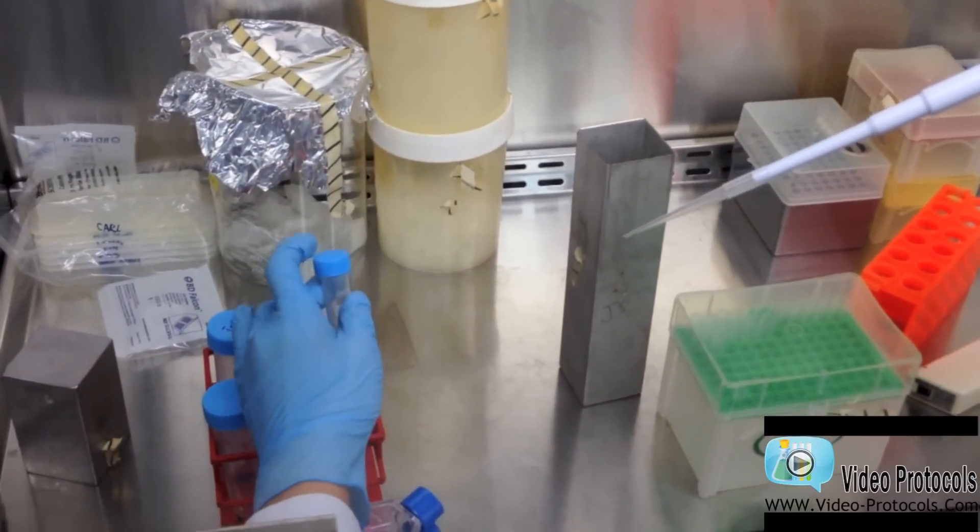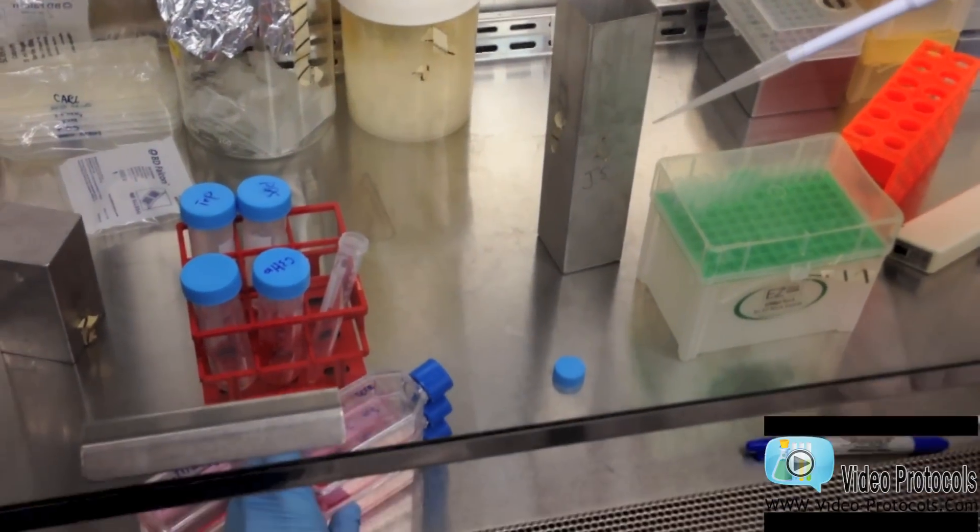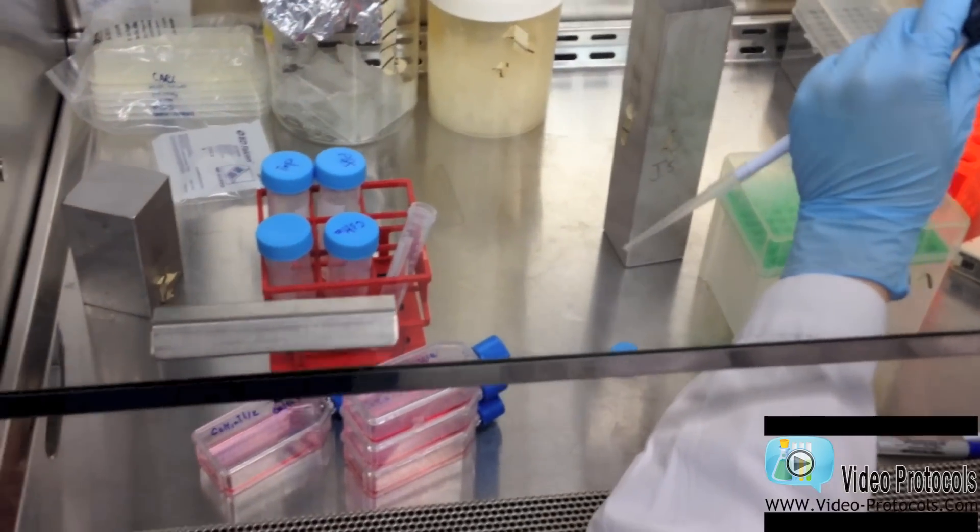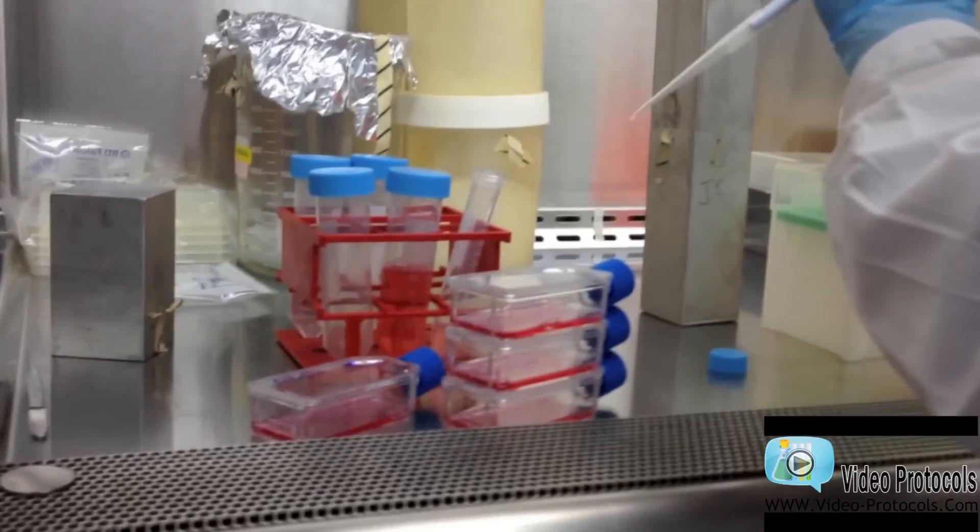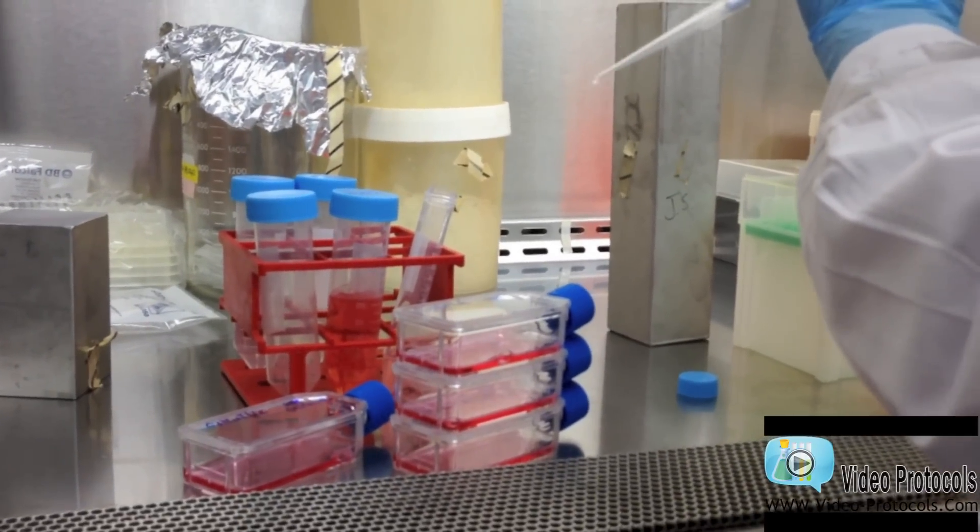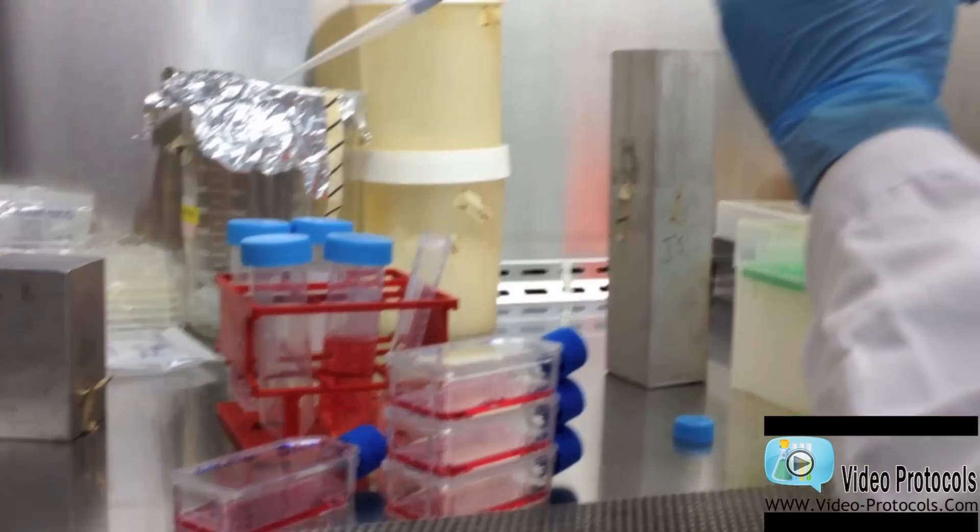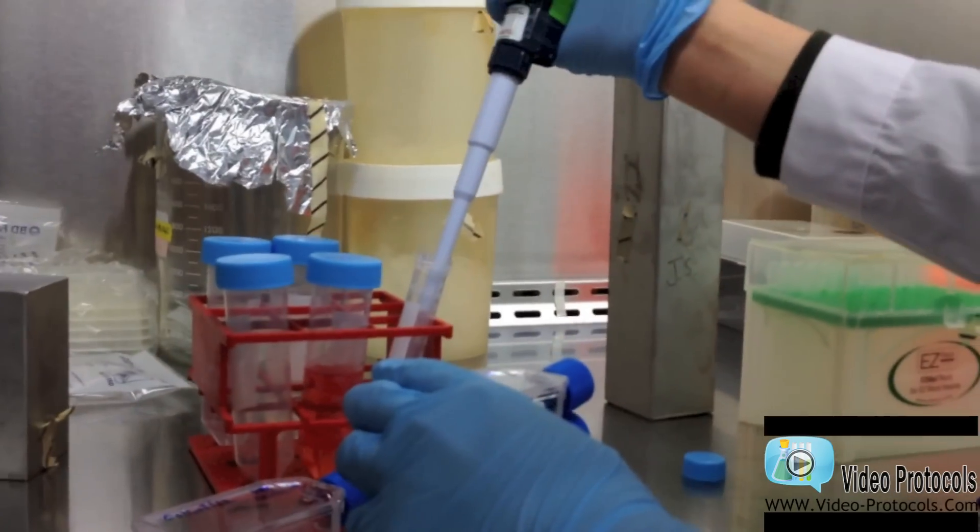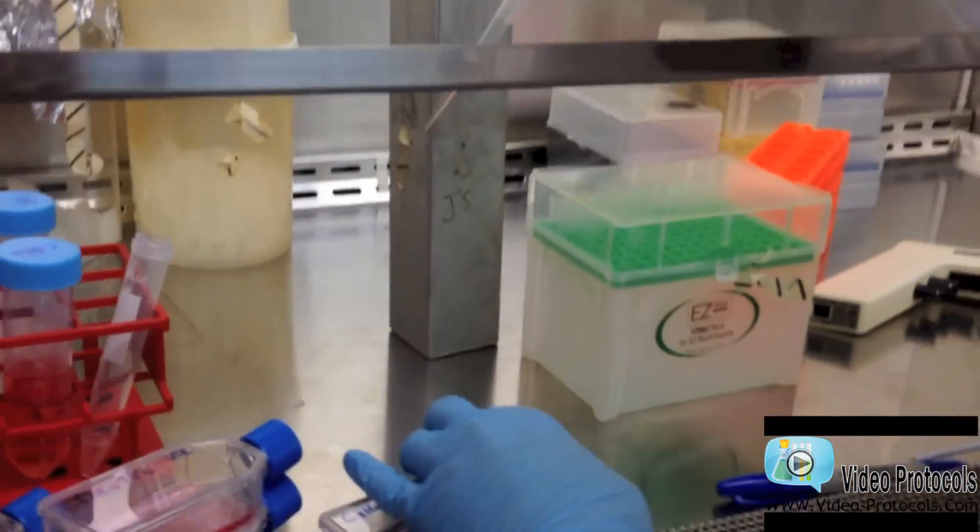This is my stock. I can then decide, for example, for these 3 flasks I would like to subculture at 1 to 4. And then use 250 microliters of cell suspension for each flask.